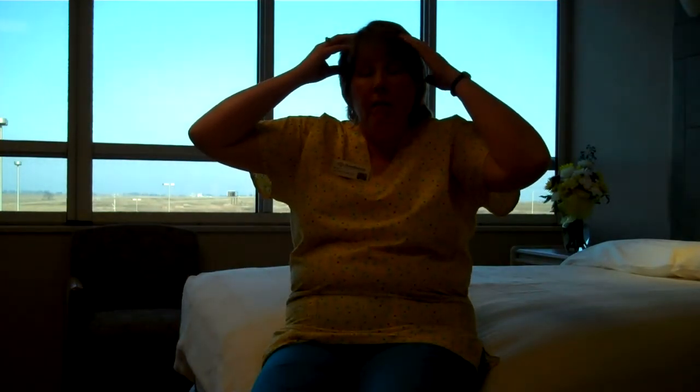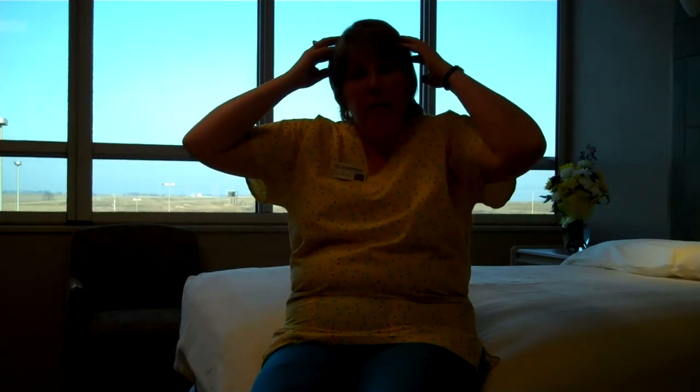Your sleep study involves being hooked up to a variety of different equipment, starting from your head all the way down to your legs. We start up here with your head. The electrodes on your head will let us know your sleep patterns as far as your brainwaves go, when you're awake and when you're asleep, and the different stages of sleep that you can be in. We'll put some things on your eyes to see when you're in dream state. We'll put some things on your chin. We'll put a microphone on your voice box, so if you snore we can hear that.